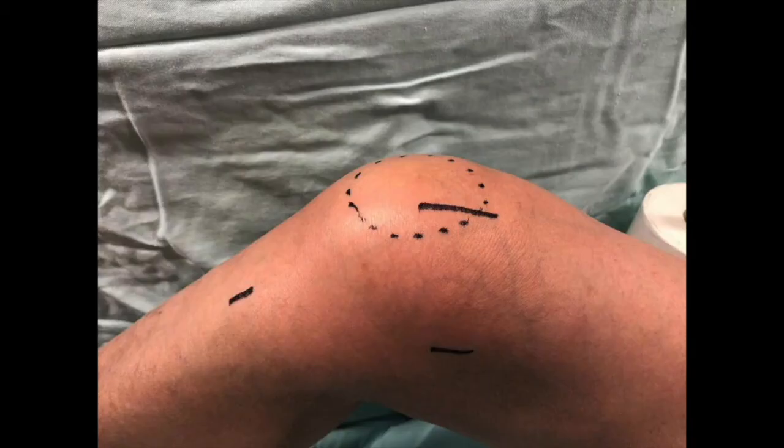Patient positioning is in the standard arthroscopy position. The surgical landmarks for hamstring harvest, Schöttle's point, and a three centimetre incision over the medial aspect of the proximal pole of the patella are marked.